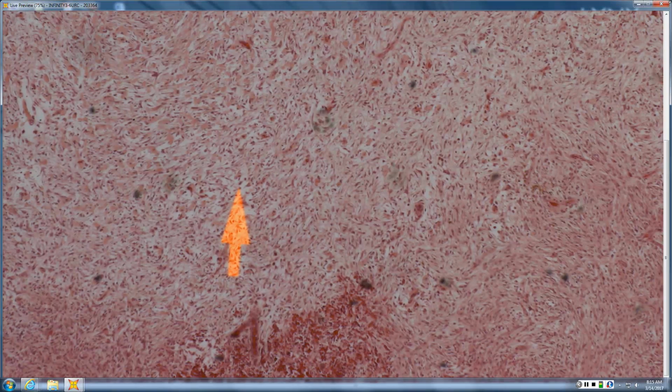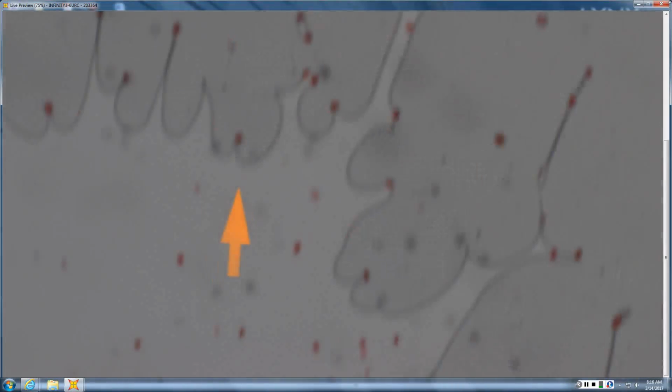Anyone want to pipe in how proliferative fasciitis differs? Tends to trap collagen, infiltrate septi, and have ganglion-like nuclei. So, another entity that we see in skin, and you need to differentiate.